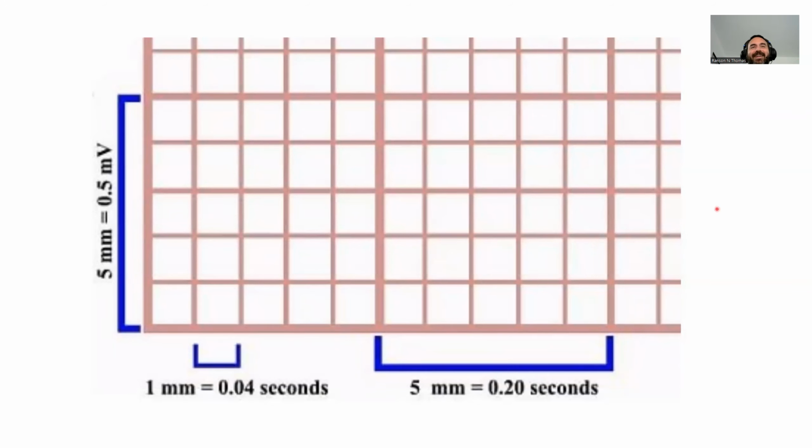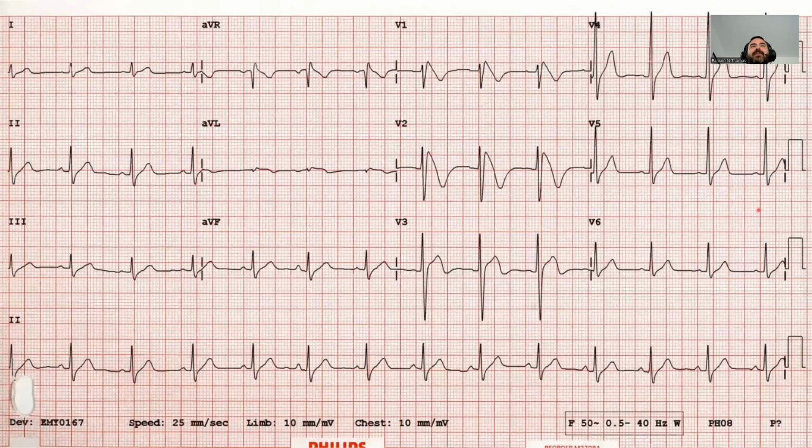But anyway, sometimes it can be a little hard to find if you're trying to be really precise. But generally, you can get a magnifying glass or something like that. There's usually something on the floors that you can get to make it easier. So, whoa, that's crazy, right?